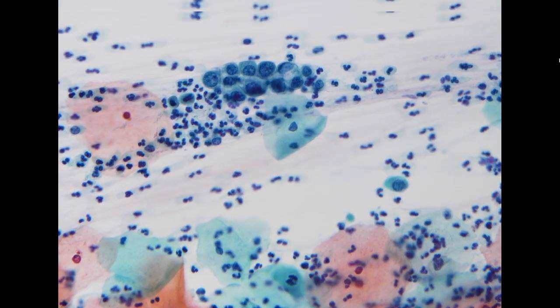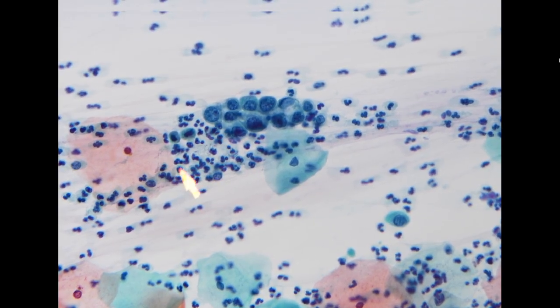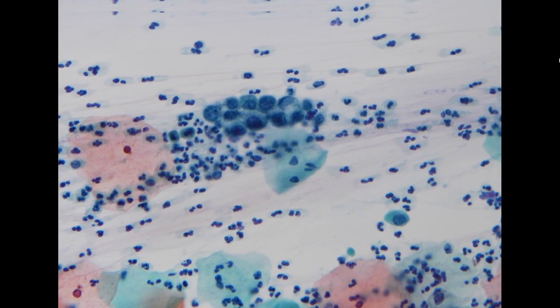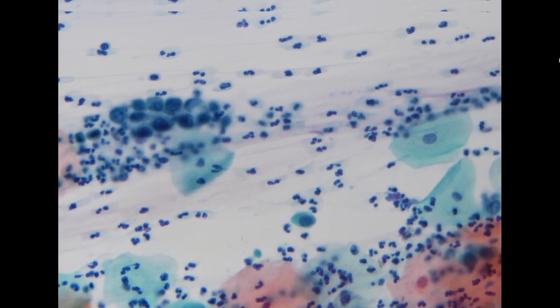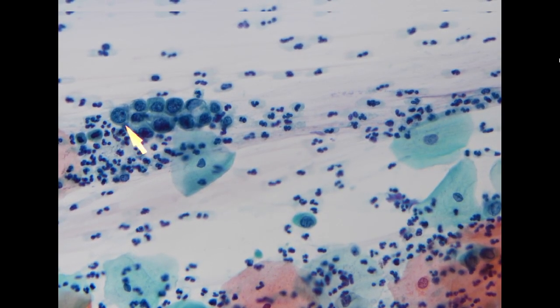In these clusters, we do see a little bit of increase in the size of the nucleus compared to our reference cell, which is the intermediate cell, not the superficial cell. So we compare with the size of the nucleus of the intermediate cells. These seem to be a little bit bigger, right?